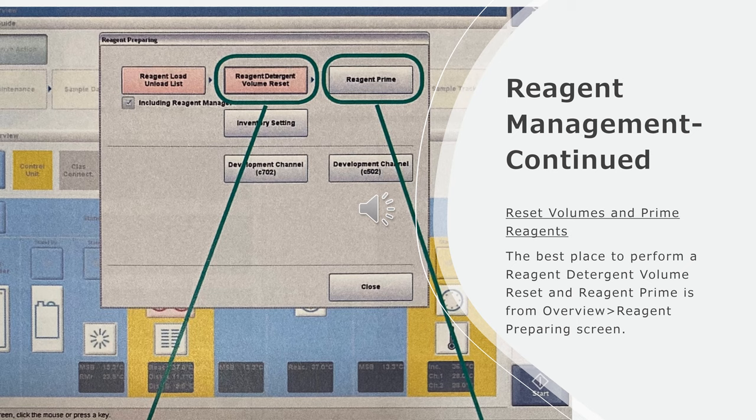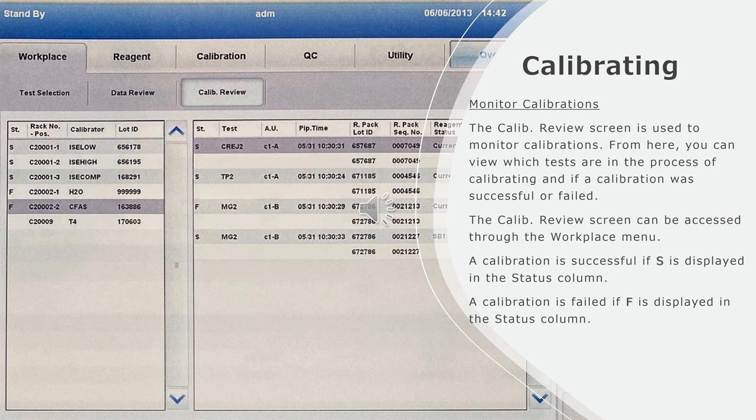Reset volumes and prime reagents: The best place to perform a reagent detergent volume reset and reagent prime is from the overview screen, and then go to reagent preparing screen.